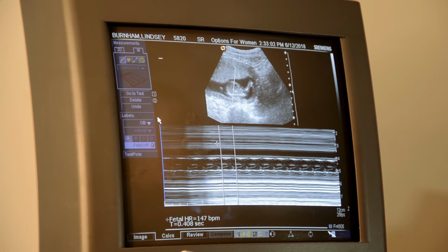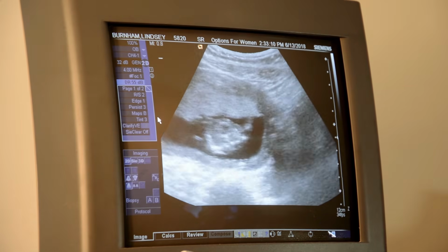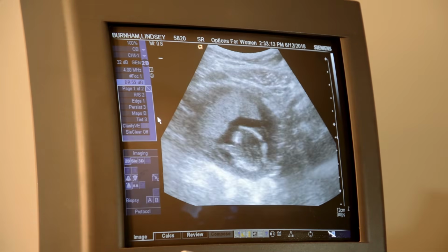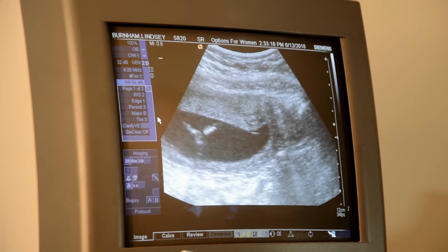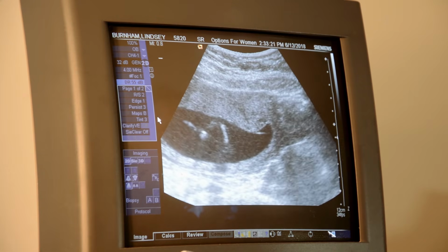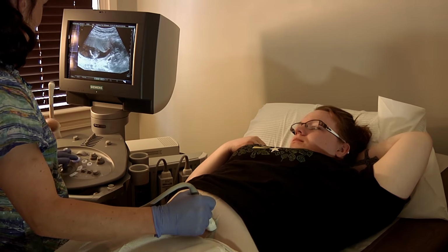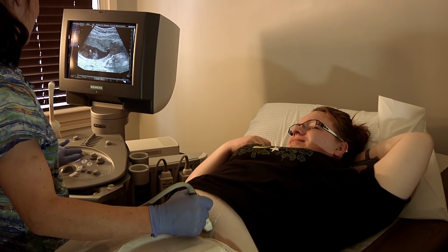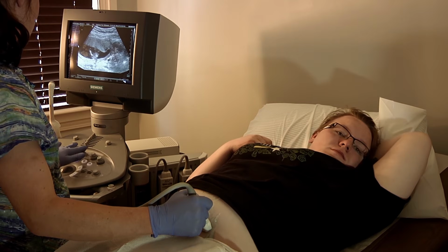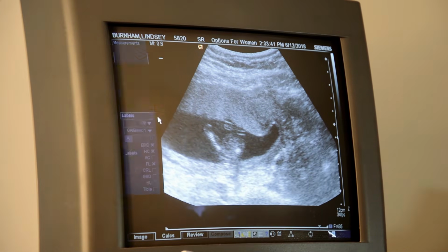147. Alright, do we need to save that one? Mm-hmm. Alright. Okay. And then go get a femur. And on the round, that's the head. There you go. That's a foot. That's a foot. And that's a femur. Freeze. Freeze. Freeze. Can we go back? Just freeze and then you can go back. Oh, sorry. Oh, you got so many good chances. Okay, now you bypassed it. There's your femur. 206, but this is a big one.